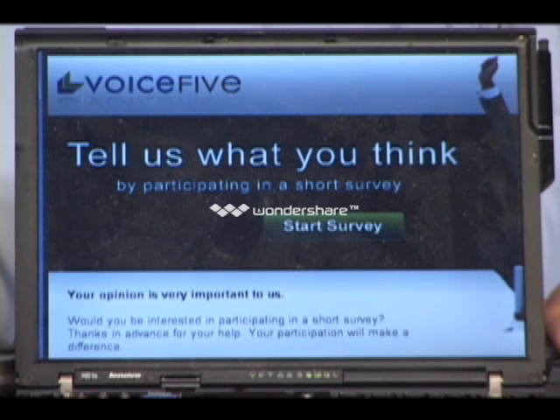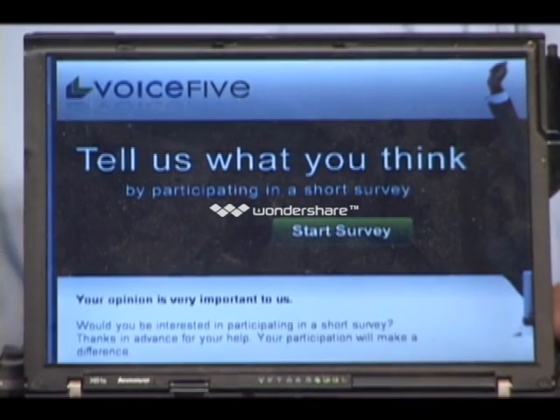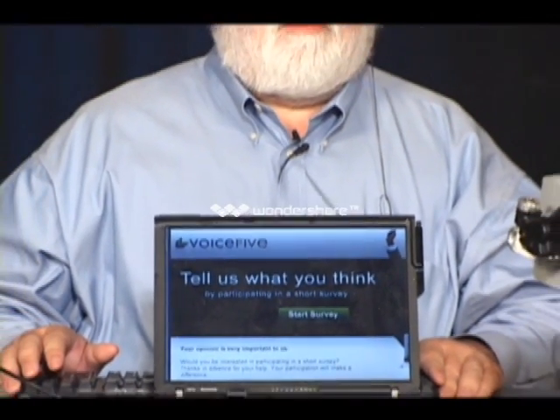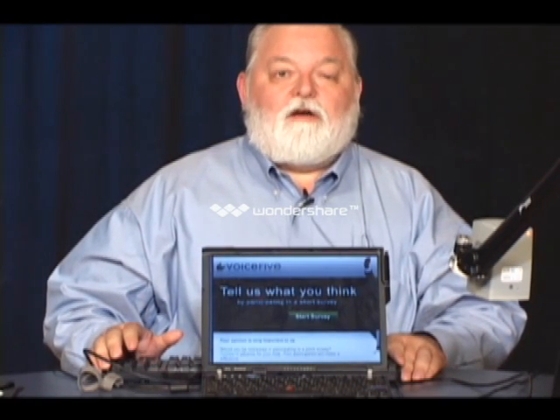You can also save things, like you can set Magic to be a certain magnification, a certain contrast, a certain color. You can set the speed of the speech if you have Magic with speech to a certain thing. And you can save those settings. So I can have settings for me, I can have settings for Neil over there, I can have settings for anybody else. And all I have to do is load their settings anytime I want to change all those settings. So I don't have to remember them or go back and reconfigure them every time I want to do that.